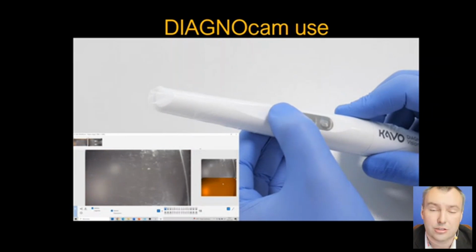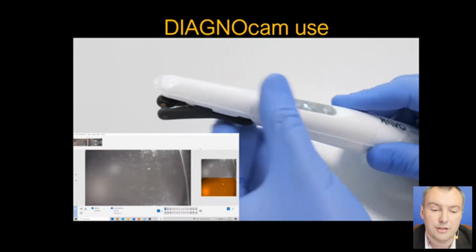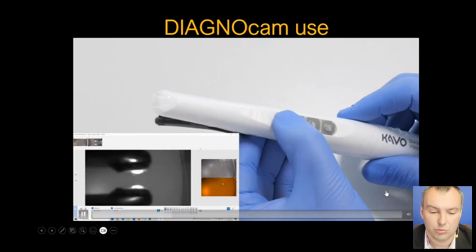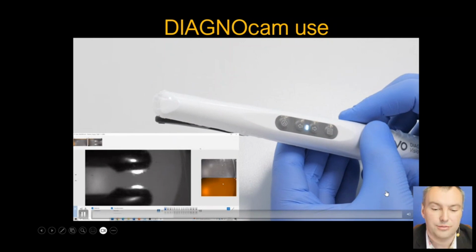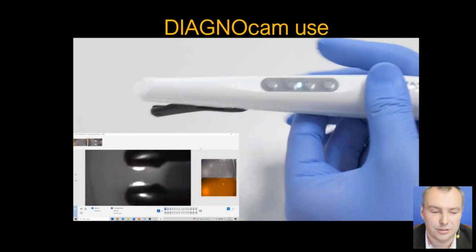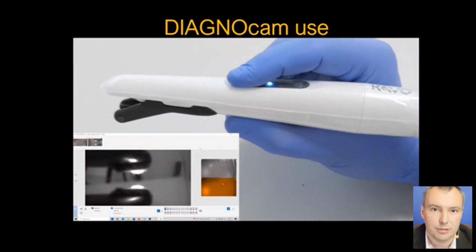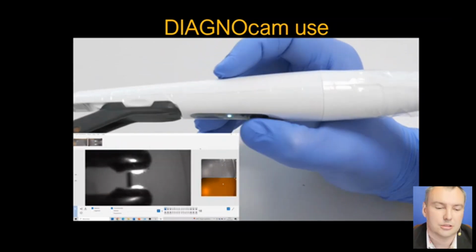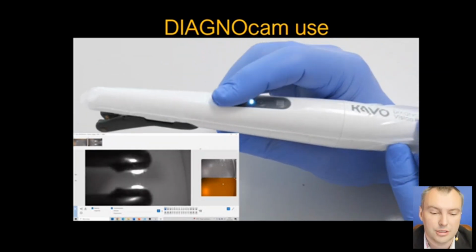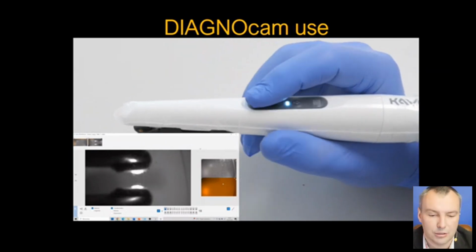Here we get only 2 pictures because, of course, transillumination does not work. Whenever we put the tip on again, it will work with transillumination again, and we will get 3 different images. As I said, don't worry about the plastic sheet. You will see it's not problematic when we work with the patient. Right now the camera is focused on it. It won't be during our work.